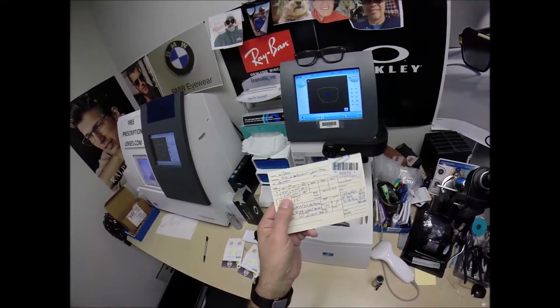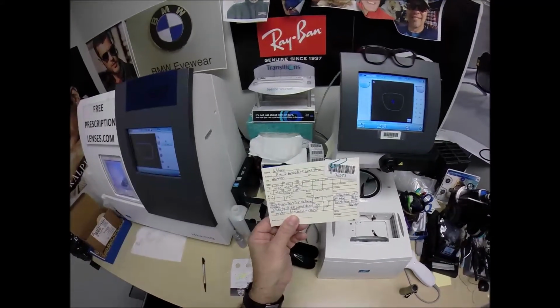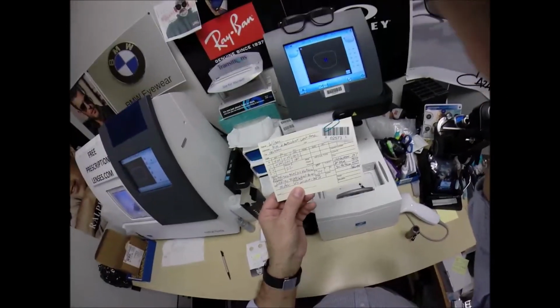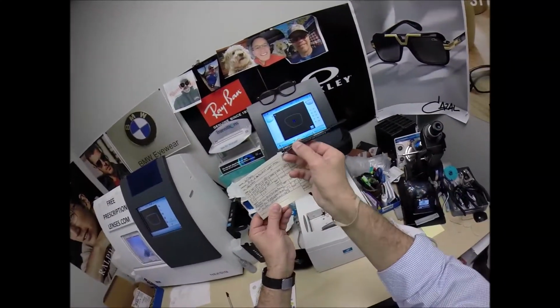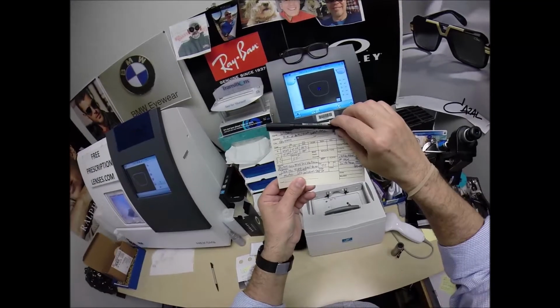Uncorrected astigmatism makes 6s and 8s look alike, with the letters P and F. Think of it as the fine-tune knob. We're going to turn that fine-tune knob to 2. A straight line is 0 to 90 to 180. So for the right eye, we turn it to 2.